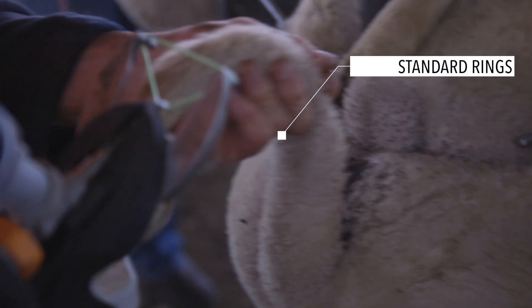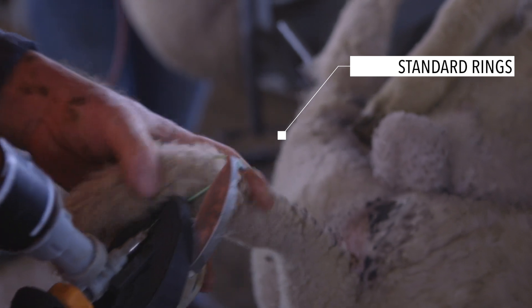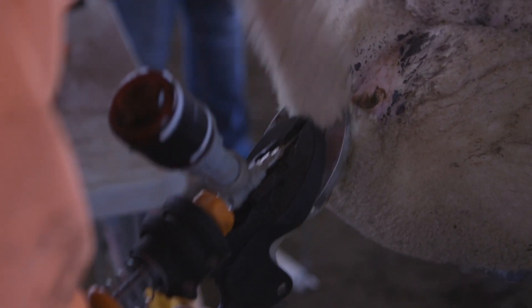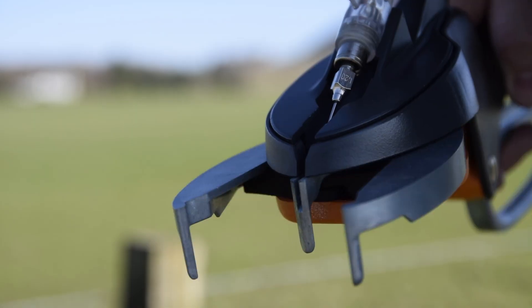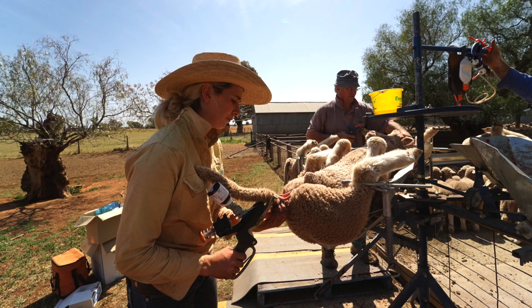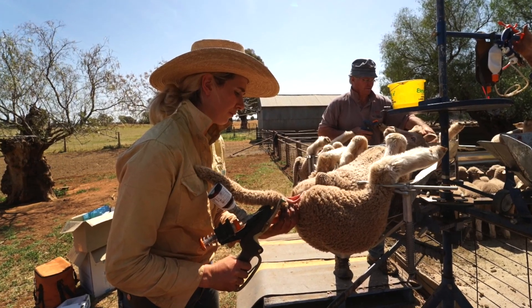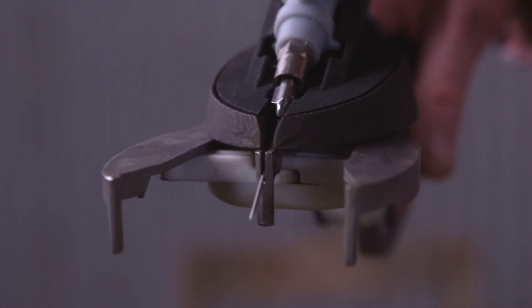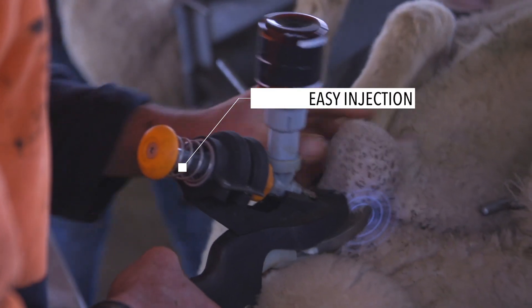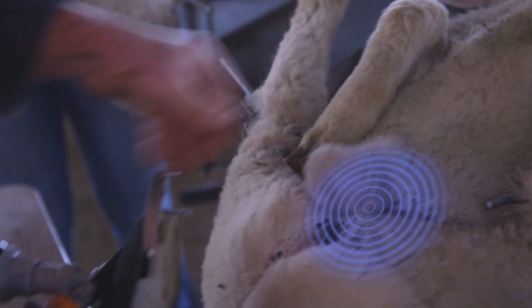There are three aspects of the tool. First, we've got the applicator — it uses the same elastrator rings as standard pliers, so from that point of view it's a familiar process. But we've considered the ergonomics of the tool to make it more user-friendly, as well as fit female hands. Crucially, it incorporates the needle and injector, allowing you to administer the anaesthetic consistently at the right spot and at the same time as applying the ring.